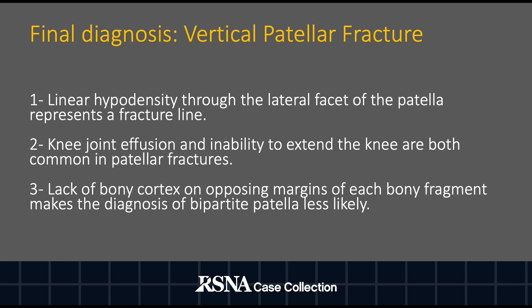The final diagnosis in this case is a vertical patellar fracture. The linear hypodensity through the lateral facet of the patella seen in several of the prior images represents a vertically oriented fracture line. Knee joint effusions and inability to extend the knee are both common in patellar fractures and were both present in this patient after direct patellar trauma. Lastly, there is no bony cortex appreciated on the opposing margins of the bony fragments — an important distinction when differentiating patellar fractures from the top differential diagnosis of bipartite patella.